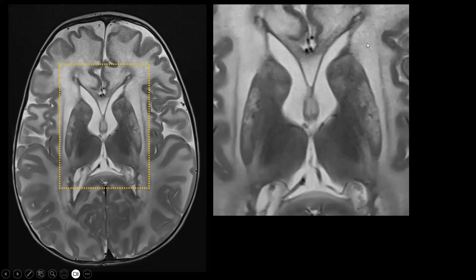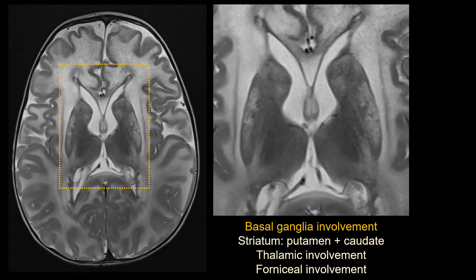Looking at the deep nuclei: there are diffuse patchy signal abnormalities involving the basal ganglia — the caudate nucleus and the lentiform nucleus — and also to a lesser extent the thalamus on both sides. The signal in the corpus callosum is also abnormal; we would expect a myelinated corpus callosum at this age especially posteriorly, but the signal is not that of fully myelinated white matter. There are also signal abnormalities in the fornix, which also looks a bit swollen. To summarize: diffuse basal ganglia involvement especially of the striatum — putamen and caudate — somewhat less of the globus pallidus — plus thalamic involvement and involvement of the corpus callosum and both fornices.